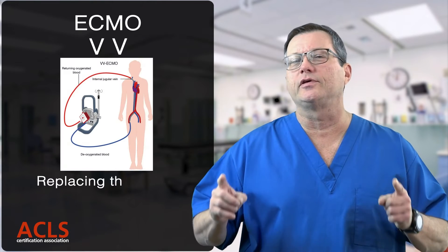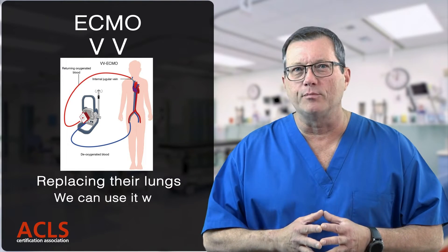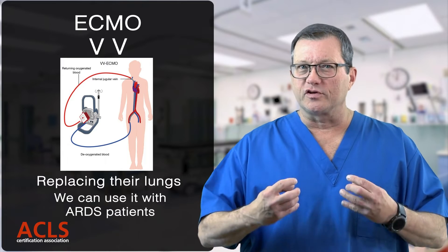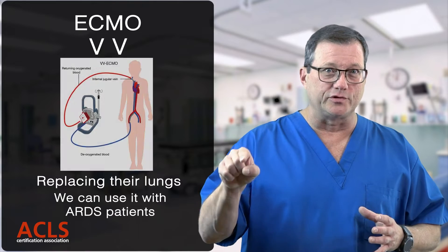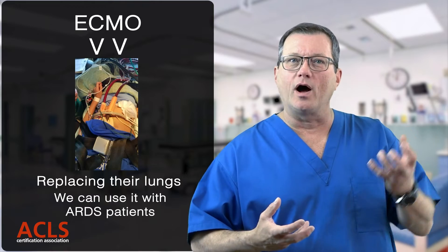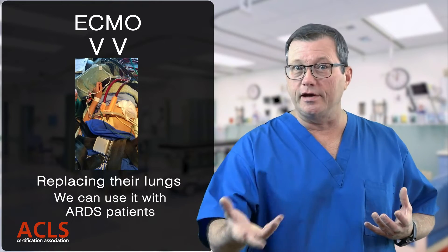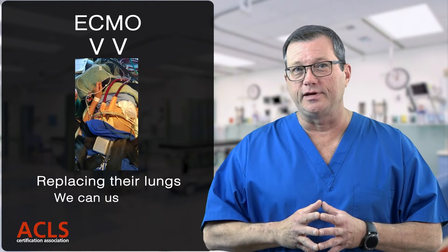VV ECMO is just replacing the lungs. Fast forward to today — we can use VV ECMO for ARDS patients. Anytime you have respiratory failure where we think we can fix the underlying pulmonary issue, we can put the patient on ECMO, give the lungs a break, let the lungs heal, wean them off the ECMO, reintroduce the patient's own native pulmonary function, and save that patient. That's VV ECMO.